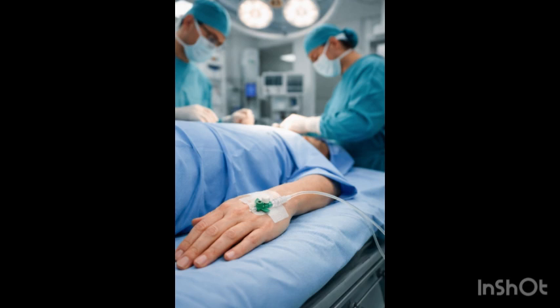And you can lower the hand to increase the venous pressure. You need to keep the patient warm, especially in theaters, because with a warm patient there will be vasodilation and you can easily place the cannula.